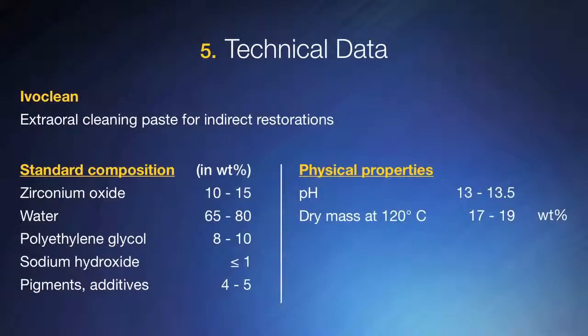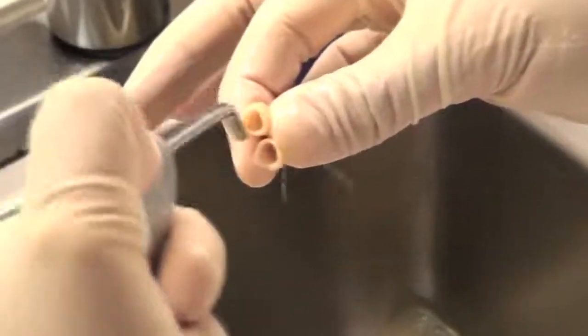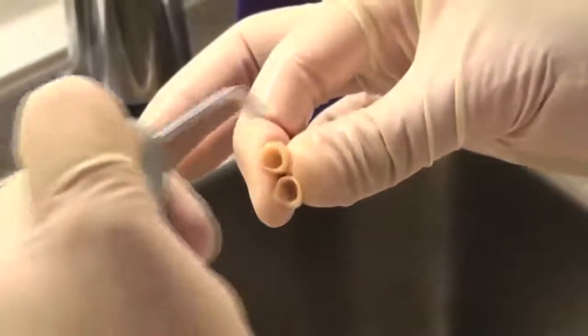So as you see, the Ivoclean is again 10 to 15% zirconia oxide particles by weight. And what I want you to notice when you see these numbers on the screen is that the pH is 13 to 13.5. So this is a very alkaline material, which means that it's very corrosive. So you need to be careful. You do not want to use Ivoclean intraorally. You do not want to get it in or around your eyes. You're wearing gloves while you're using it as well.